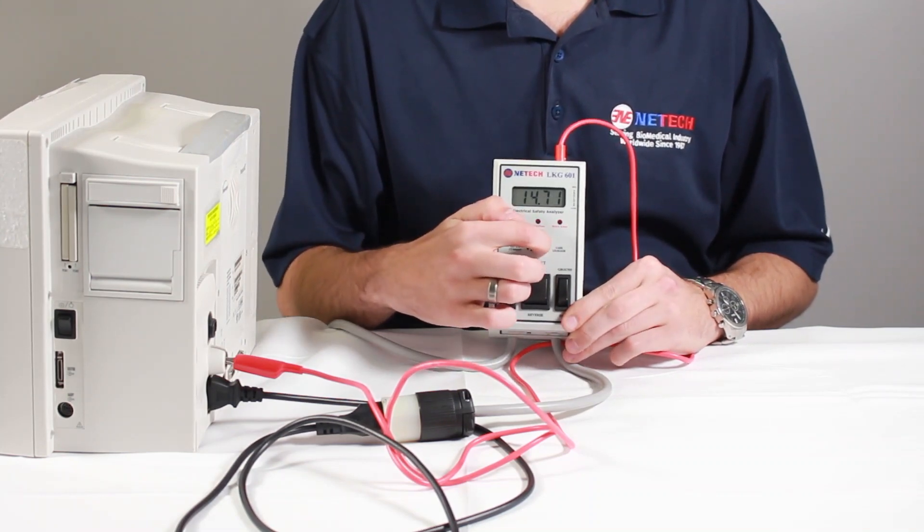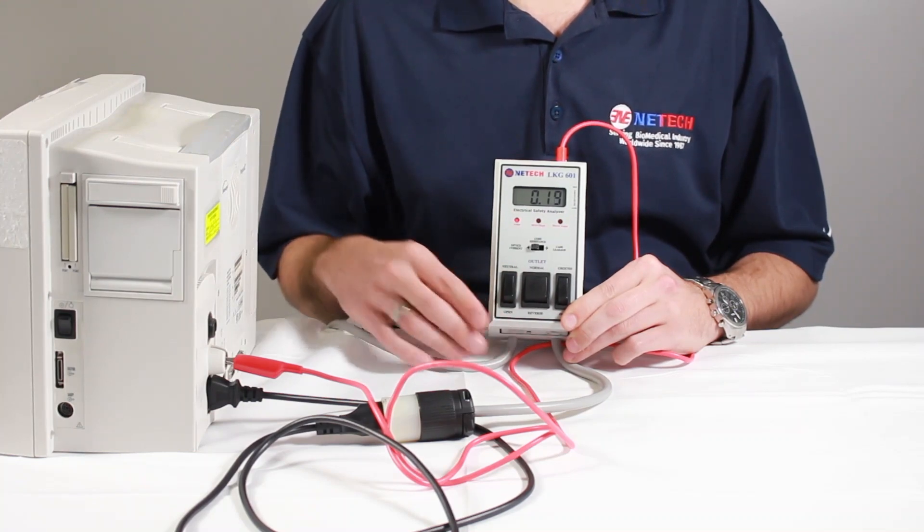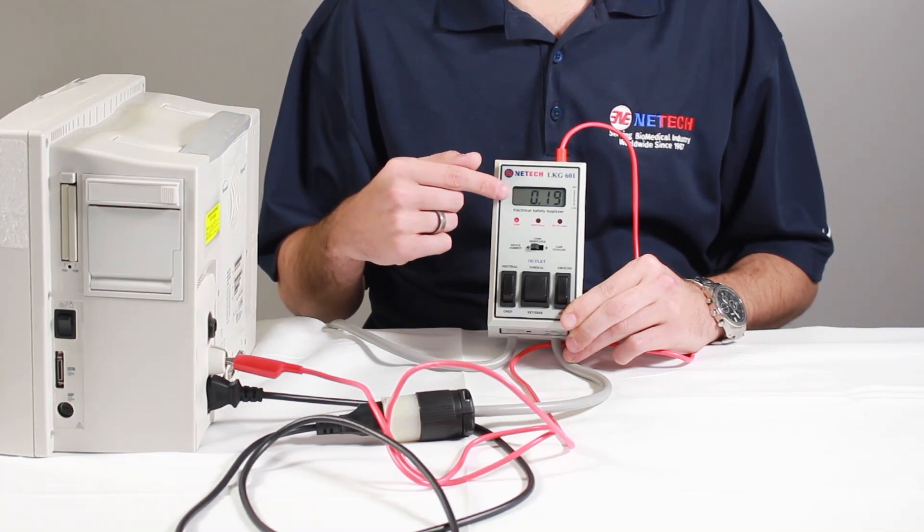Finally, move the three-position slide switch to device current. The result will be measured in amps and displayed on the LCD screen as shown.